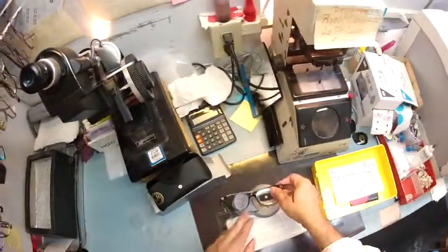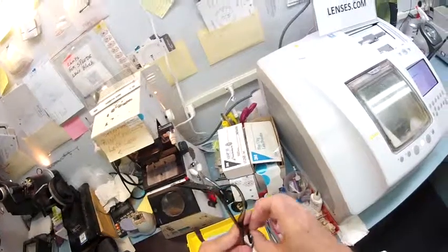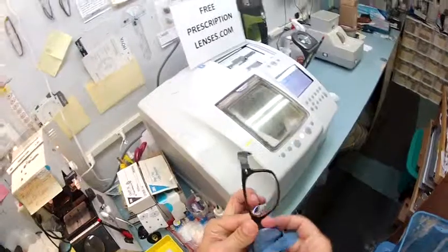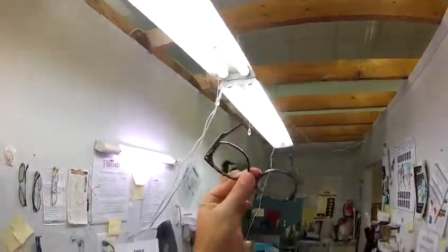So this block is no longer needed. I'm going to pull that off, take it off, dry it off, throw it back in the bin. I'm going to pull my little 3M sticky pad off. That's no longer needed. And I'm going to use my cleaning cloth to dry everything off, and then I'm going to inspect it up to the light to make sure there are no blemishes, no waves, no scratches, no nothing.